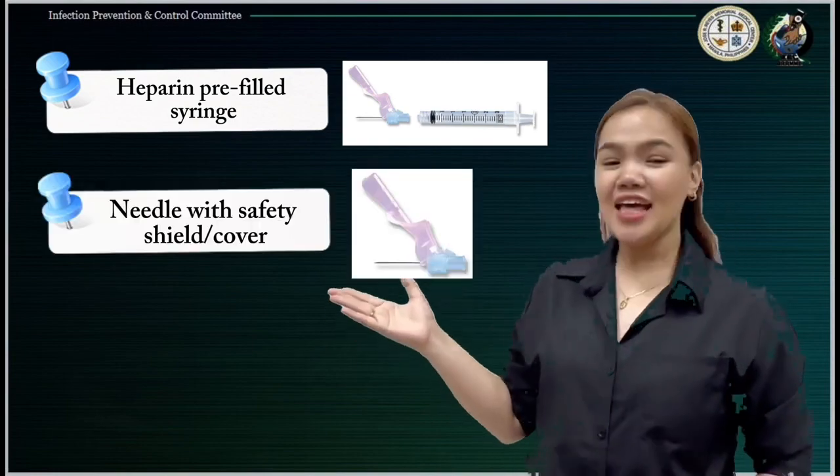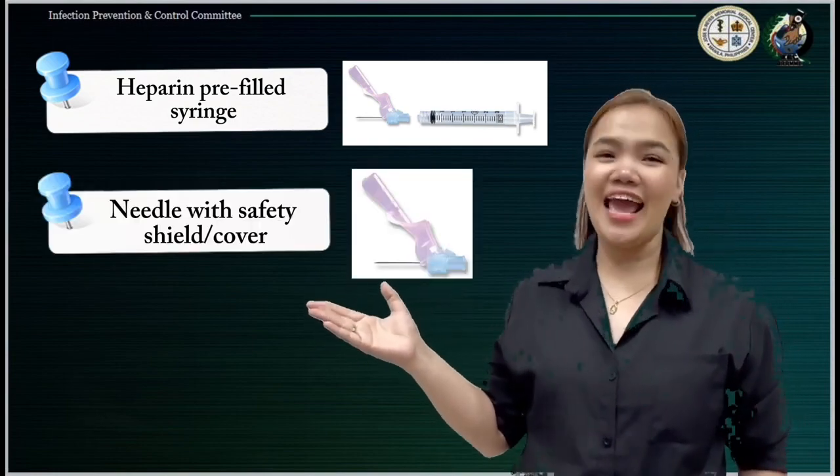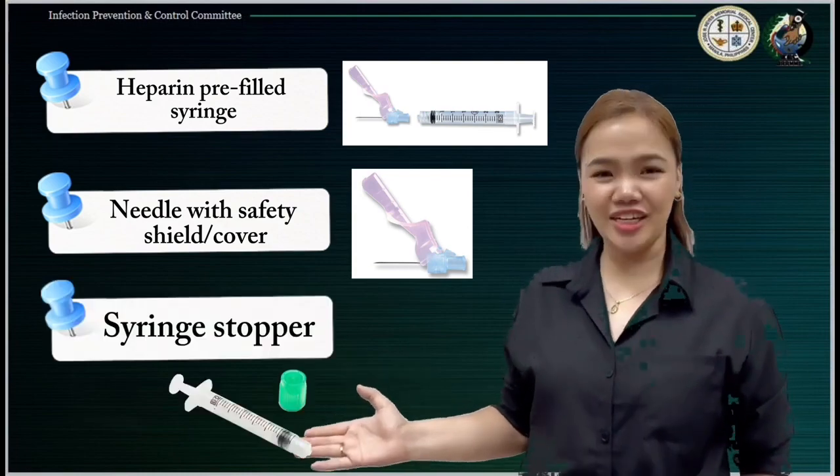Second, the needle with safety shield or cover. And lastly, the syringe stopper.